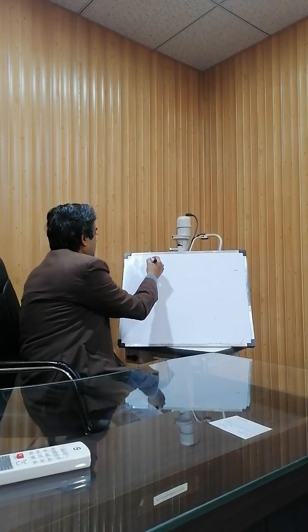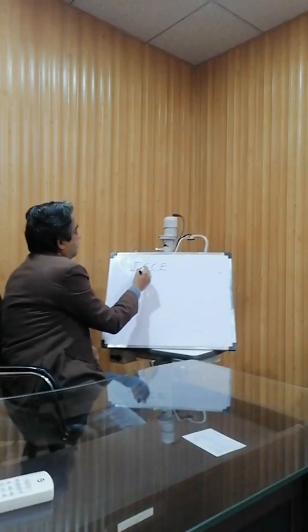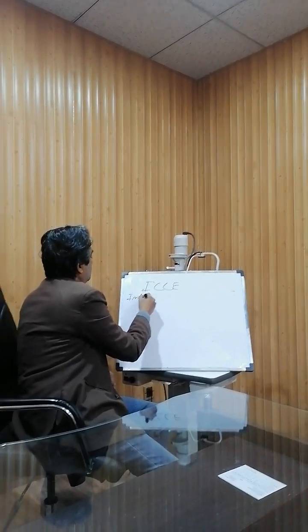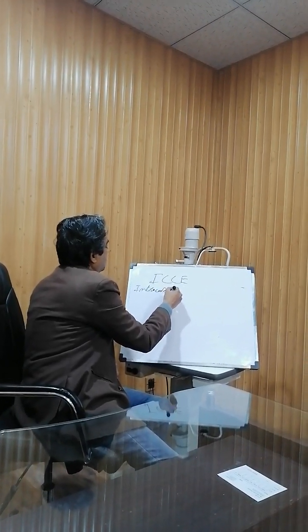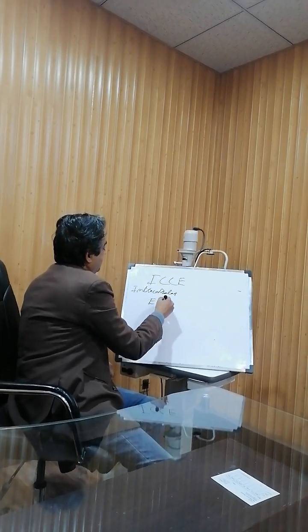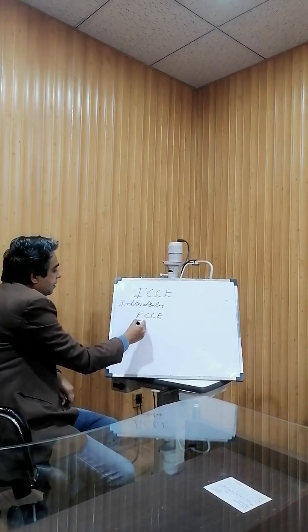Number one, ICCE. It is called intracapsular cataract extraction. It is now almost obsolete, done only in very special conditions. Then we have the ECCE, extracapsular cataract extraction. This is now the procedure of choice.